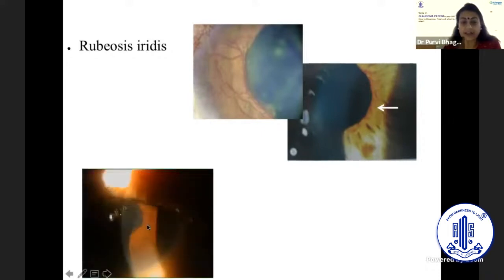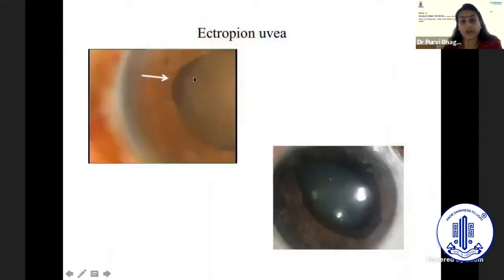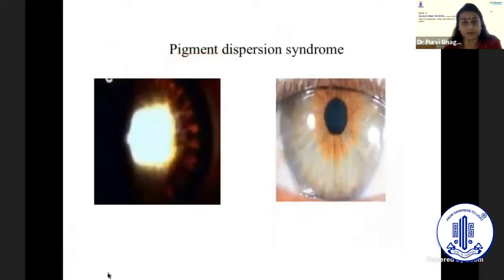And even here, you can see just a single vessel lying there, which will tell you that now this patient is going into a case of neovascular glaucoma, and your management will entirely change. And along with that, you can also see that a localized ectropion is also developing. So the ectropion could be either sectoral or it could be a 360-degree ectropion.